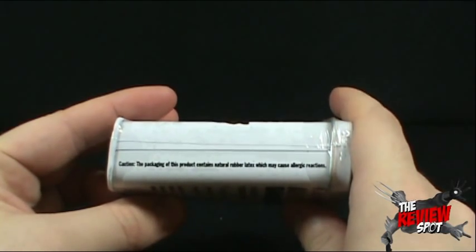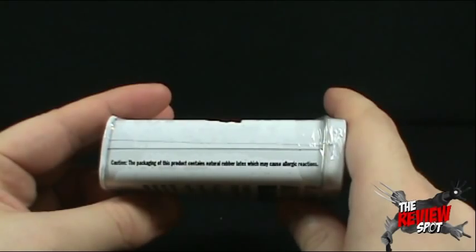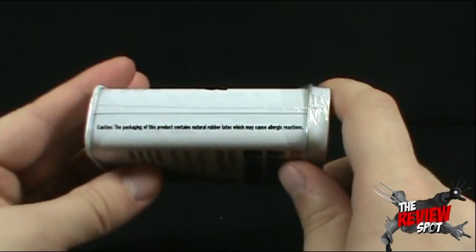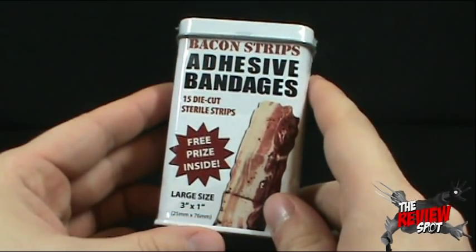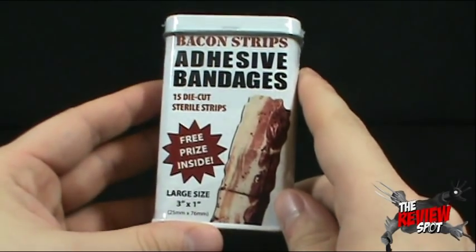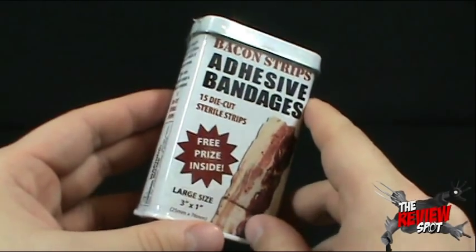On the side: caution. Packaging of this product contains natural rubber latex, which may cause allergic reactions. So if you are allergic to latex, you might want to stay away from these adhesive bandages. Oh, there's a free prize inside too. It's the large size — and I think it was also the only size. I don't think there was any other size available. Three inches by one inch.